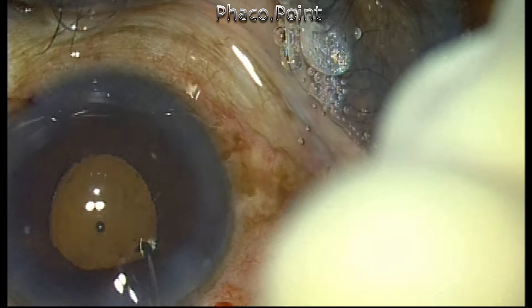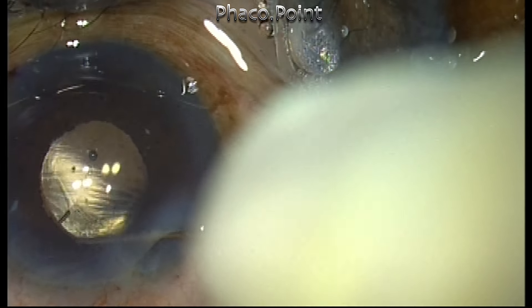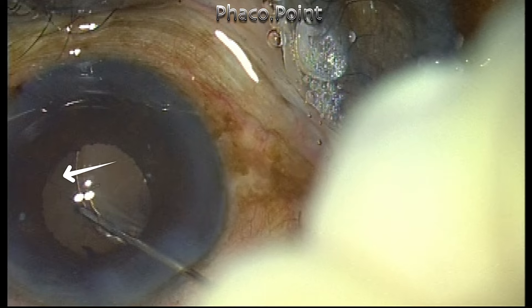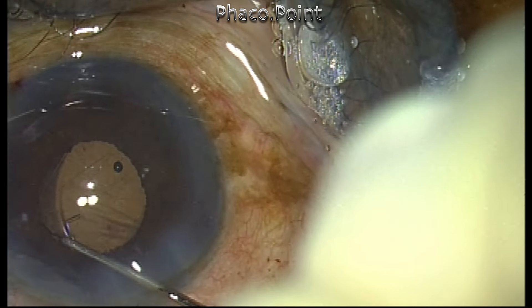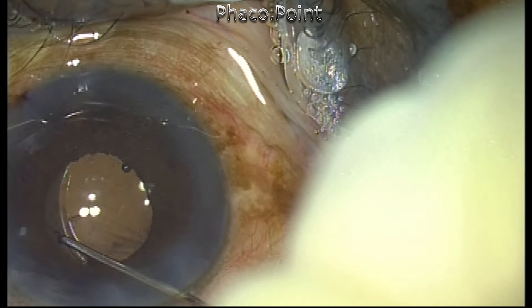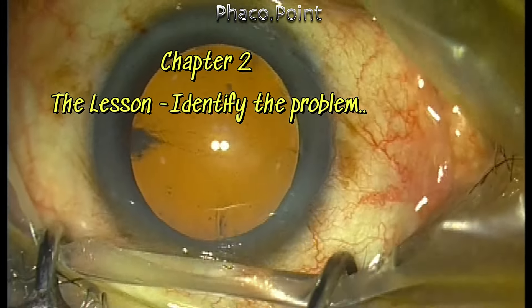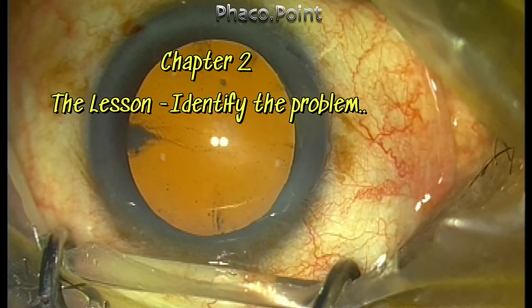It was at this point that I got a rude shock. I found that the trailing haptic of this lens had been truncated and cut, which is the reason for the decentration of this toric IOL. In this particular case I had to explant the lens and use another intraocular lens instead. The lesson we learn is to identify the exact problem that happens with these hydrophobic acrylic lenses.